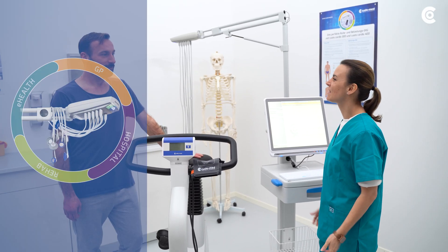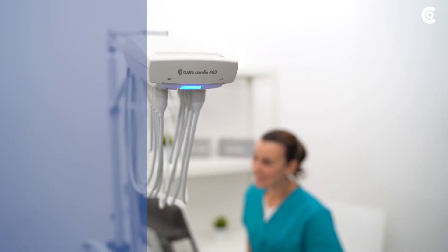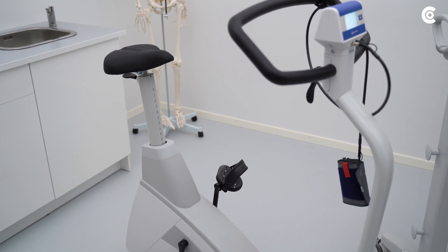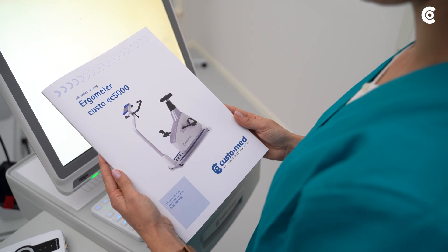In the following video I will explain the procedure of performing a stress ECG with Custo Cardio 400 on an ergometer. Please take note of the manufacturer's instructions for safe use of the ergometer.